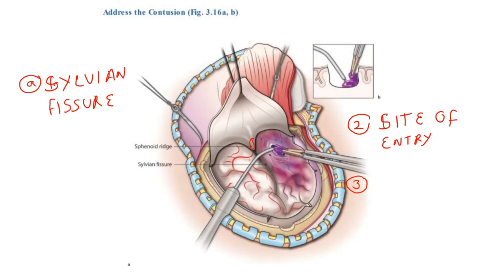Important pearls for this phase: you can identify the sylvian fissure with the help of the sphenoid ridge or the middle cerebral vein, but the sphenoid ridge is the more reliable landmark. When entering the cortical cavity, use a malleable retractor supported by a cotton patty moistened with saline — this helps in retraction and illumination while protecting the underlying brain. Evacuation of the hematoma is always best done with the help of the operating microscope.